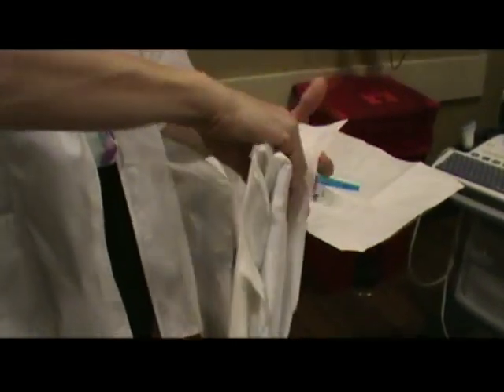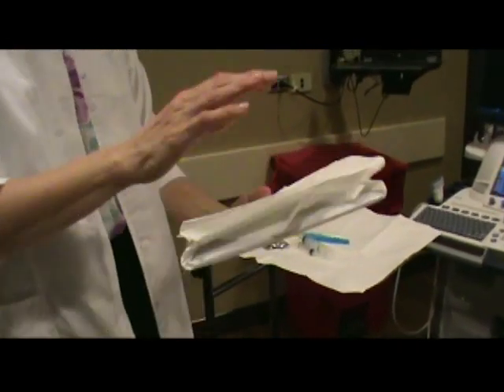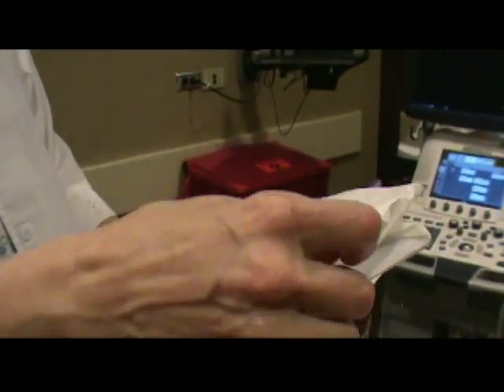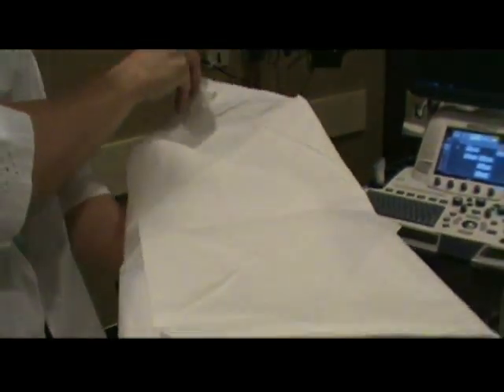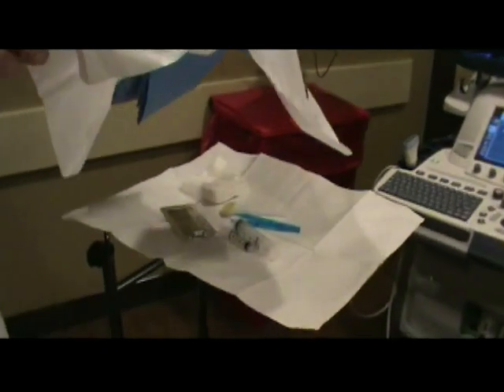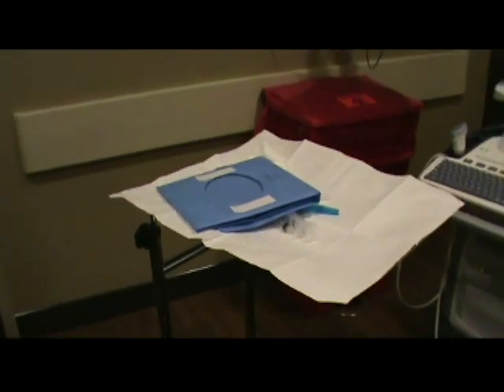You're going to grab the drape out itself. Now this is an actual outer protective, so it maintains sterile even though you're not. So you want to be very careful when you open your tabs using your sterile technique. And at this point, grab this, hold this piece back, and drop it onto the sterile tray. And that maintains all the sterility.